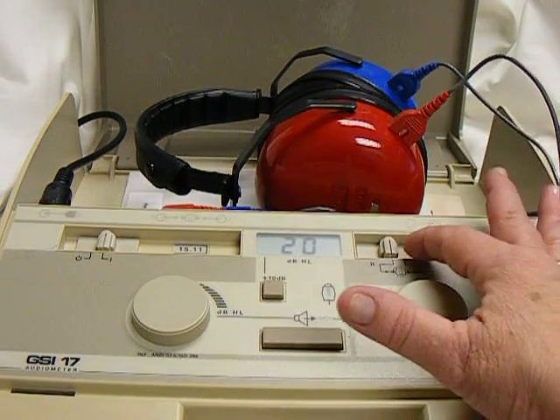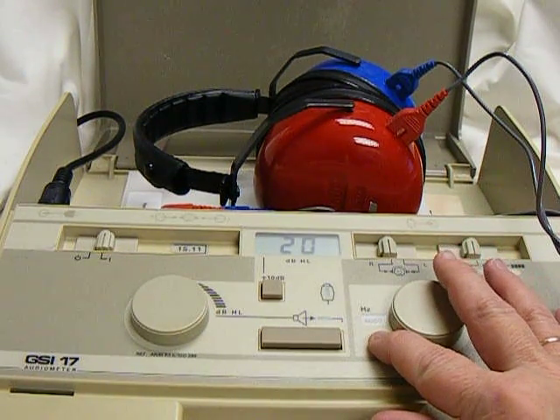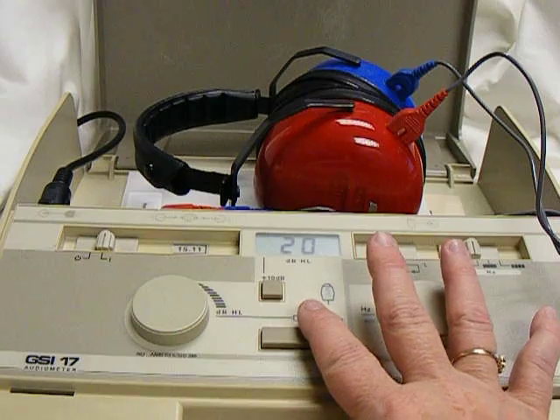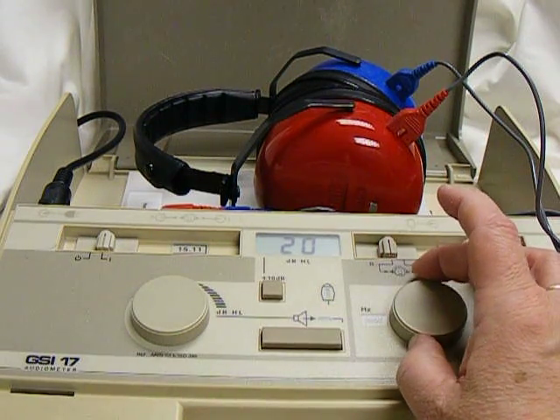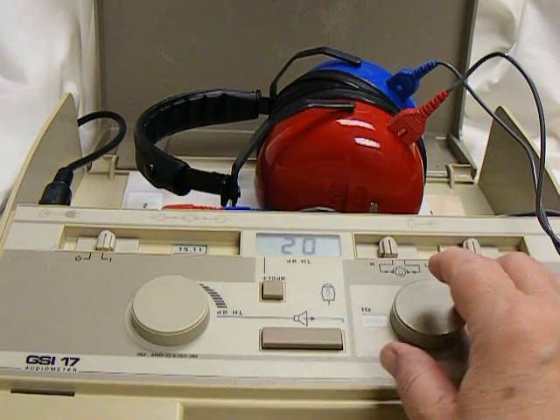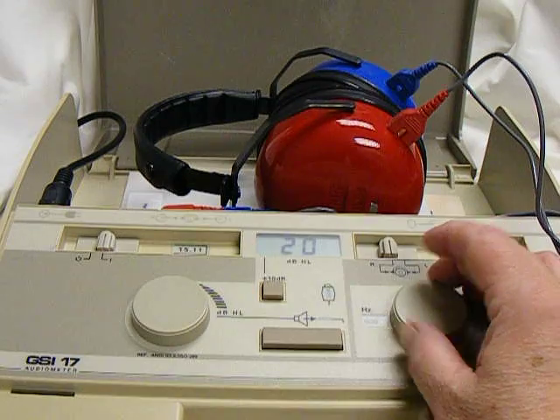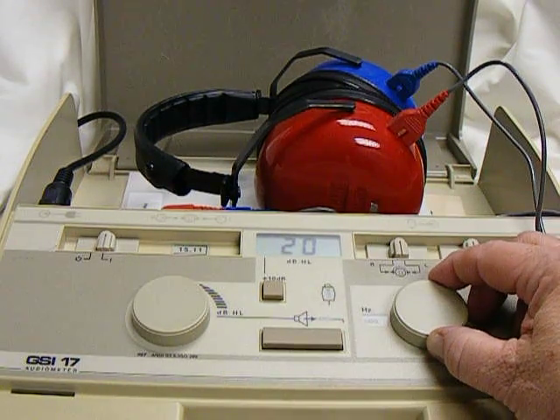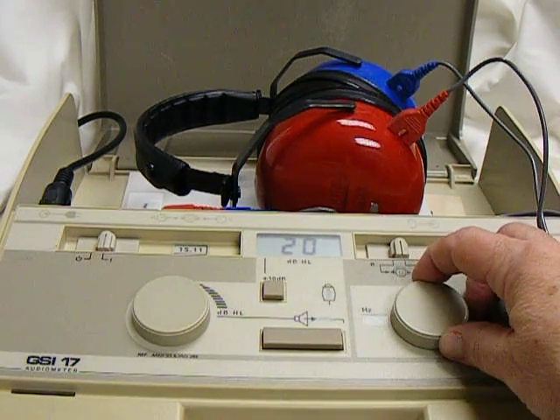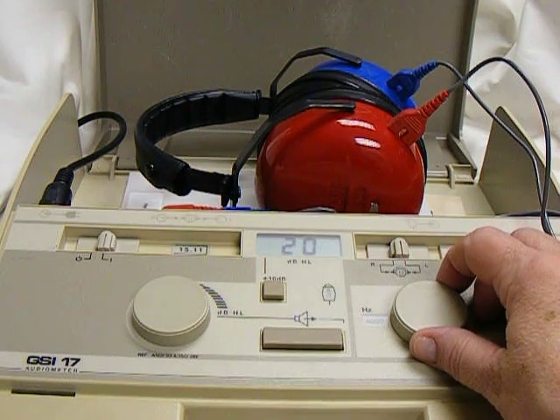Now to present the tone, we always start in the right ear. For elementary students, we would start at 4,000 Hz. Present a tone. If they respond, go to 2,000. Present a tone. Go to 1,000, then 500. Switch ears and go back: 500, 1,000, 2,000, 4,000.